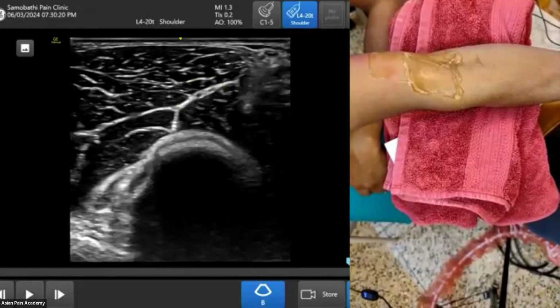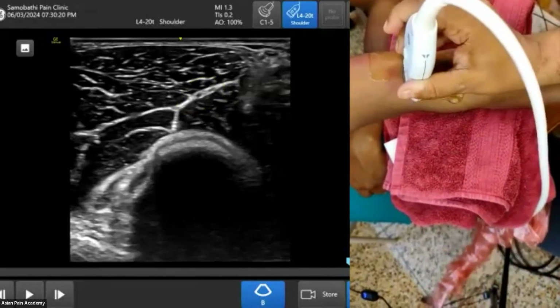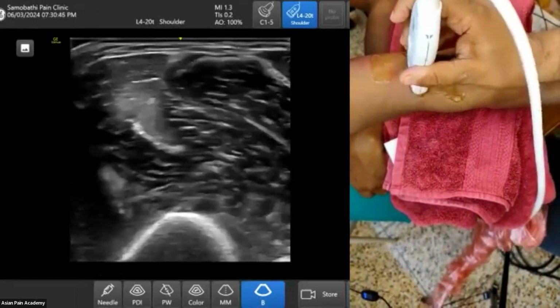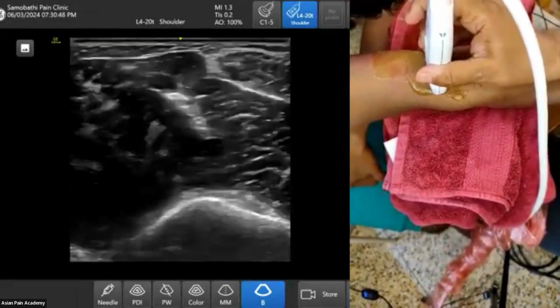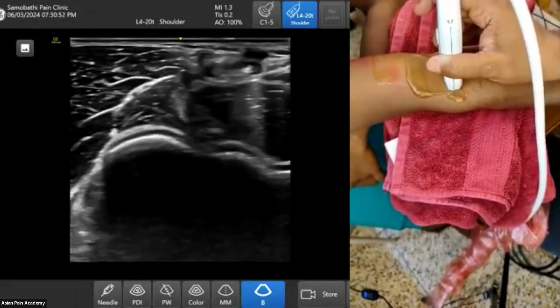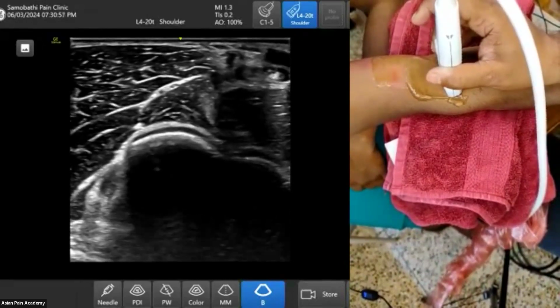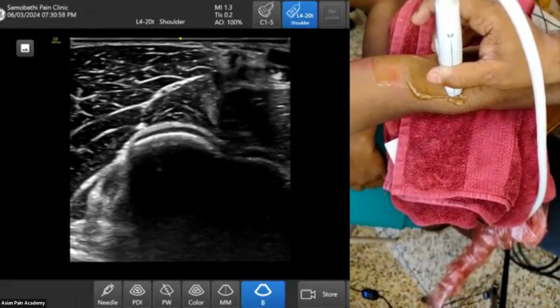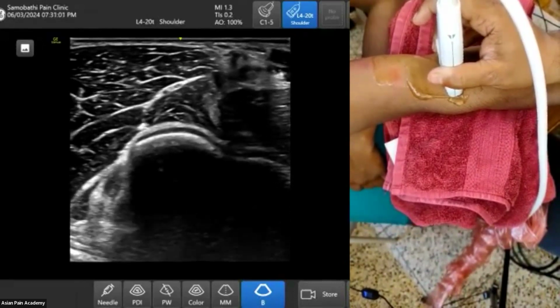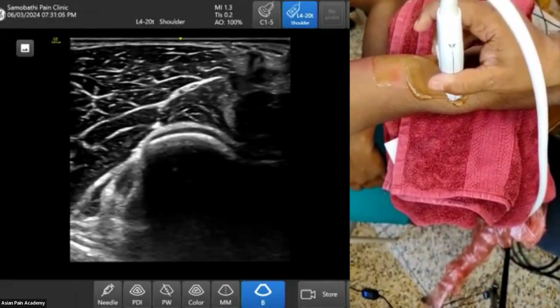Yes. So this is the radial nerve. It is very easy to locate. Again, I am showing you the simplest way to locate it. Just follow the shaft, making it a wavy margin. I have done this 3-4 times, so it is very easy. And this rounded portion of the bone, which is very hyperechoic, is basically the capitulum. The radius attaches with this capitulum.